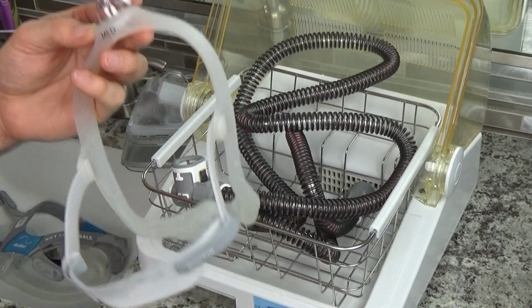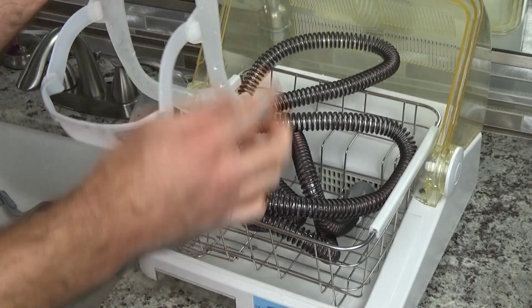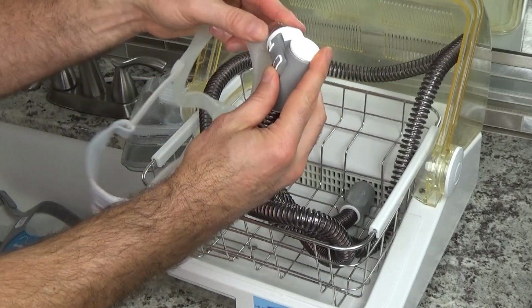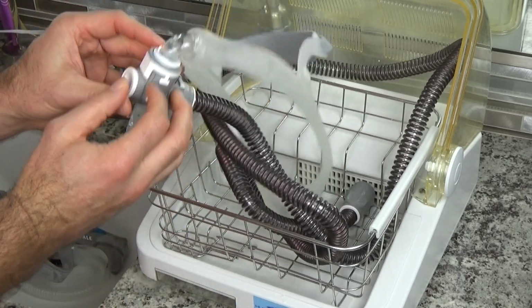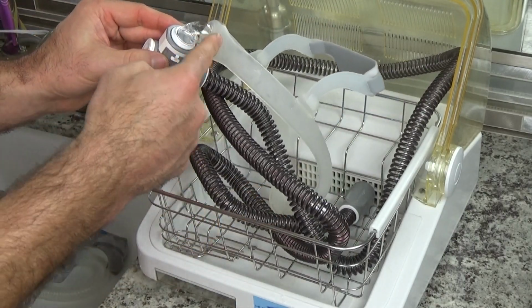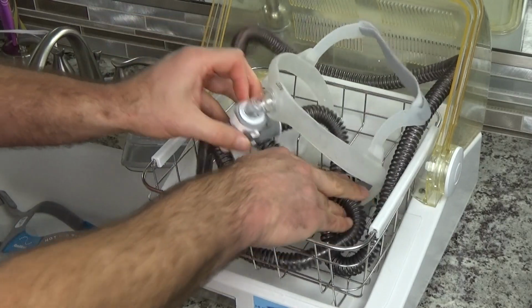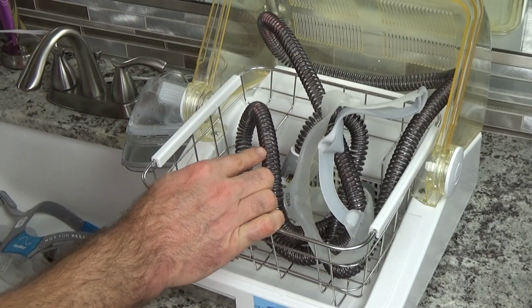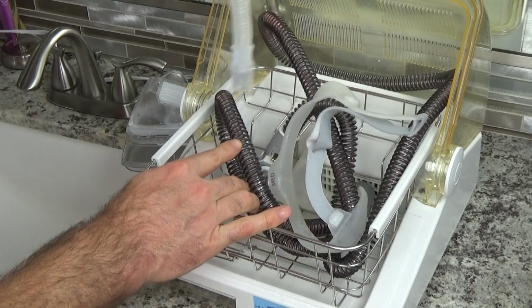Now the next thing I'm gonna do is with a mask like the Dreamwear, anything that has the tubing like this, I'm gonna plug it directly into the tube because that is going to, if you can see that, shoot the hot air through here and it's also gonna get it through this tubing, which is exactly what we want. Really don't have to worry about getting this arranged in here correctly. Same with this, I'm just gonna drop this in.